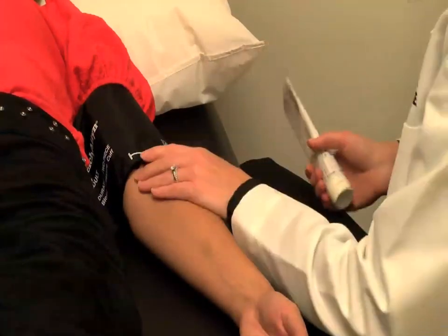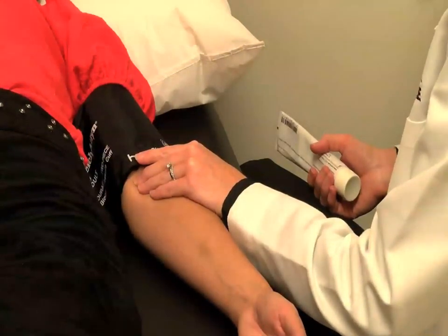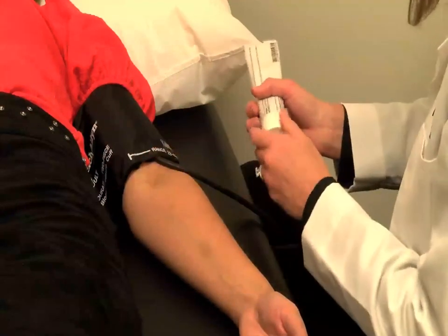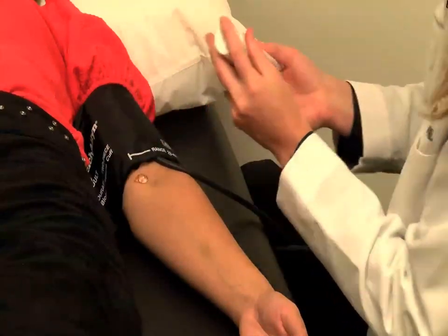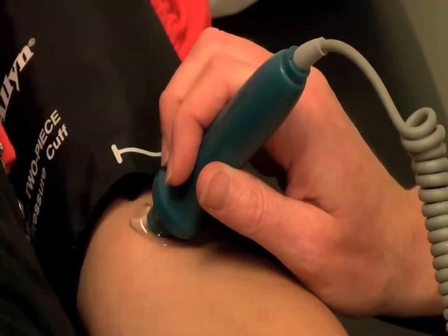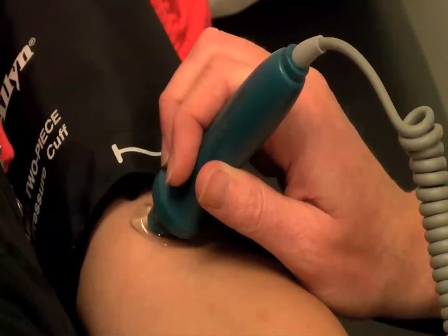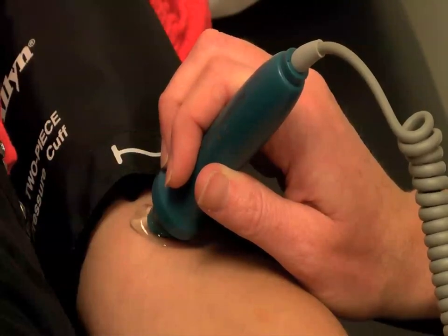Next, secure an appropriately sized blood pressure cuff around the arm, taking care that you can still access the brachial artery and you're able to locate the brachial pulse with your fingers in the patient's antecubital fossa. Then, apply a generous amount of ultrasound gel over the brachial pulse. Slowly adjust the Doppler probe to obtain an audible signal. The best results are obtained by holding the Doppler probe at a 40 to 60 degree angle toward the heart.